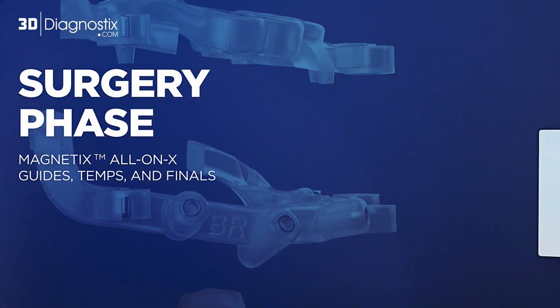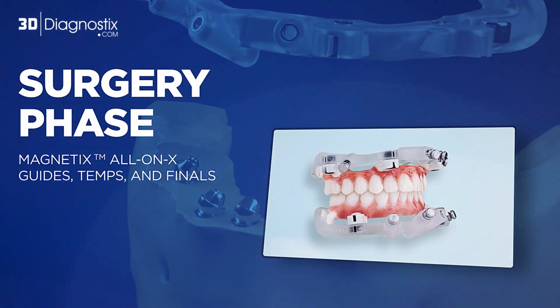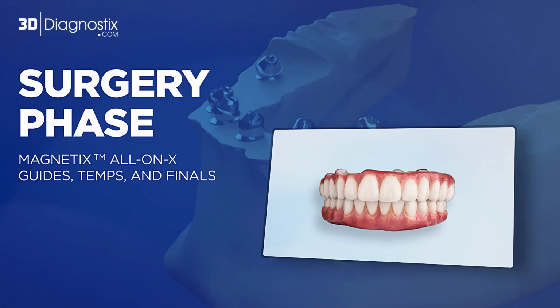For fully guided surgery steps, you can refer to the previous video detailing the Magnetix GFMR workflow, or you can use this technique with freehand surgery.